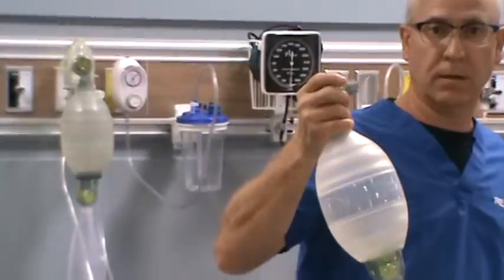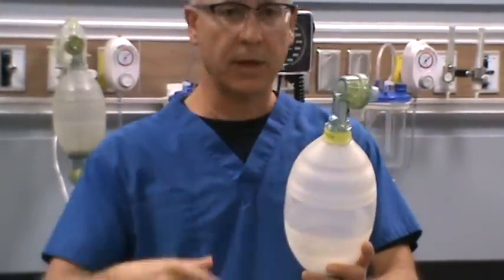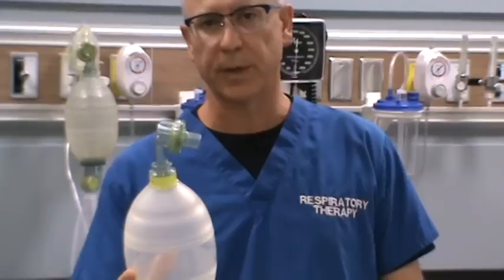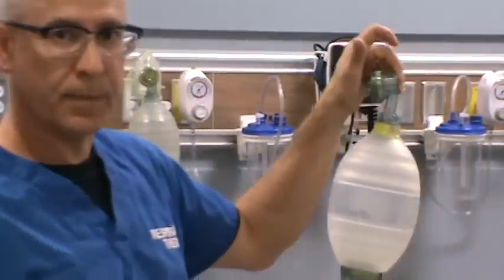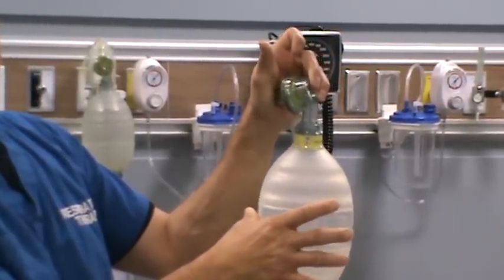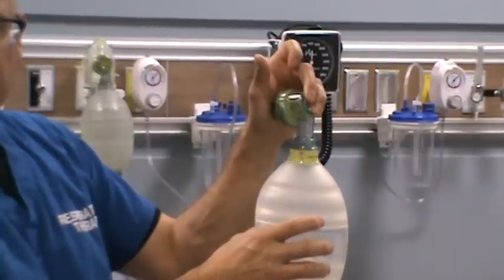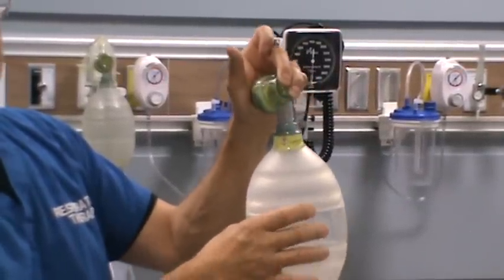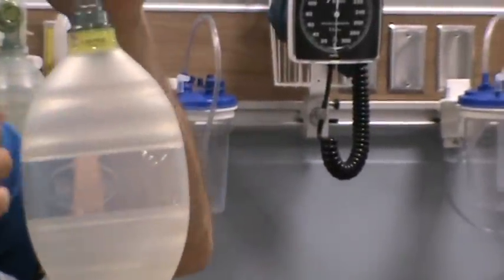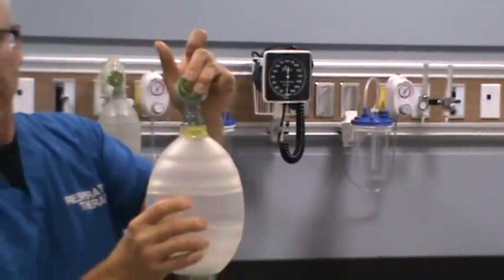Some manual resuscitators only allow one pressure test, and the most important one is the positive pressure test. The positive pressure test checks for leaks — it tells you if there's a leak within the patient valve assembly, the bagger itself, or the gas inlet valve assembly. To do the positive pressure test, simply block off the patient valve assembly where the gas would go to the patient, and squeeze the manual resuscitator. You should feel resistance, shouldn't feel any gas leaking, and shouldn't be able to compress the bag. If gas stays in the resuscitation bag itself, you've got a good bagger with no leaks.